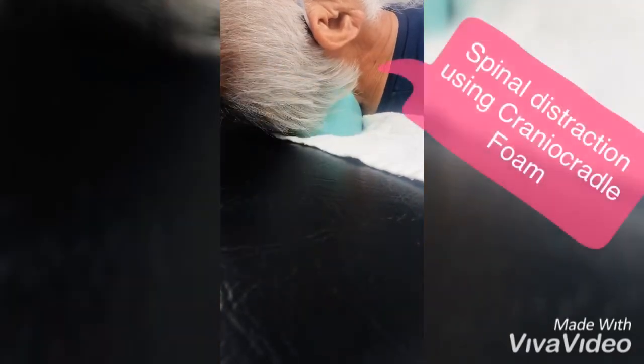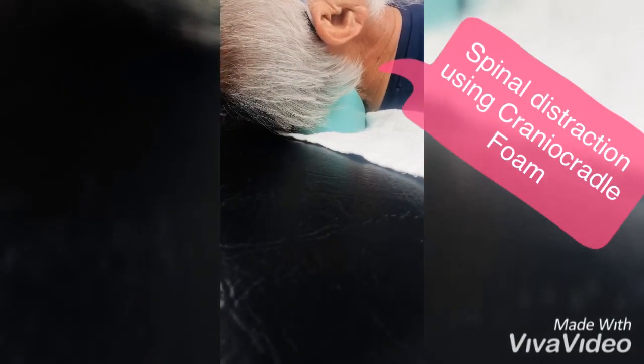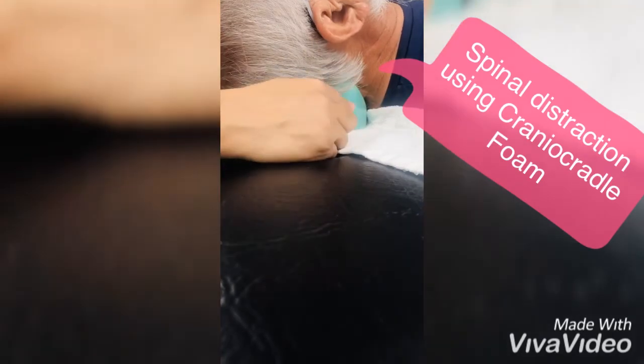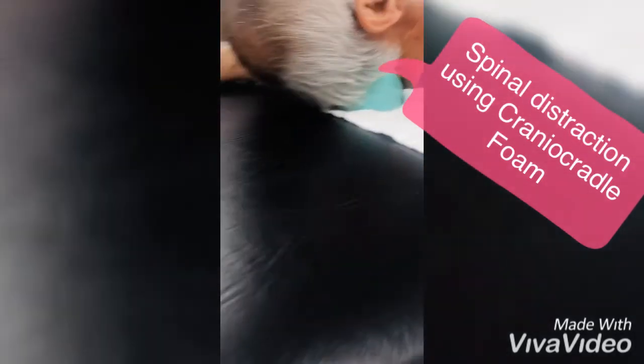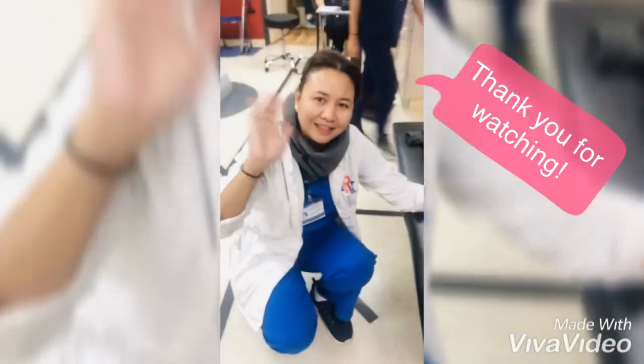Hold 15 seconds, and then we're going to release. There you go. This is what the cranial cradle does. This is one of the tools that we use for cervical distraction here in Therapy Resources. Dr. Lynn, thank you.